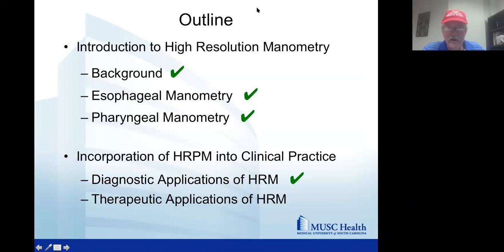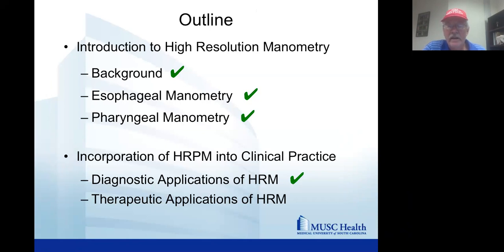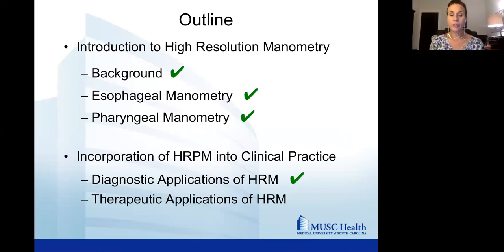Hey, Ashley? Yes. I have a question from a surgeon in the audience. Certainly. If you take your non-Zenker's patients out of the mix, out of 50 patients that come to a tertiary dysphagia center, laryngology center like yours, how many people end up getting high-resolution manometry? I just want to make sure I understand the question. If we take out the patients that we do this for Zenker's, we also do it for cricopharyngeal myotomy.